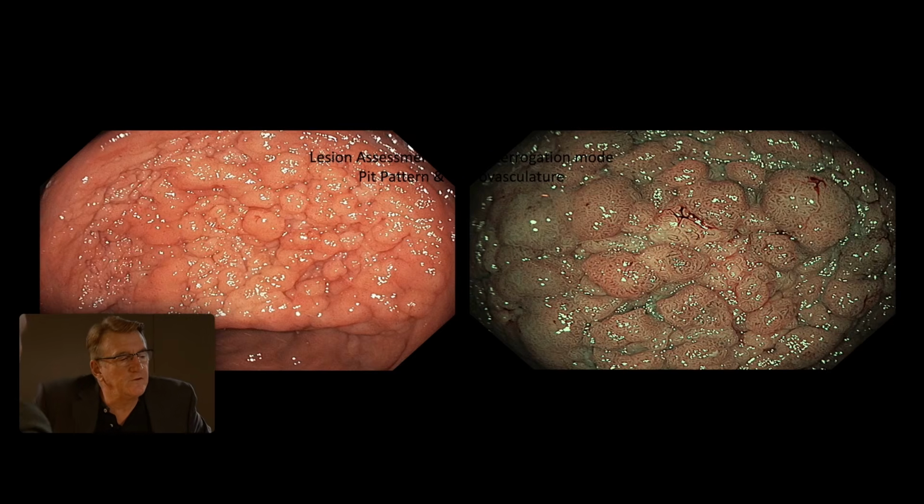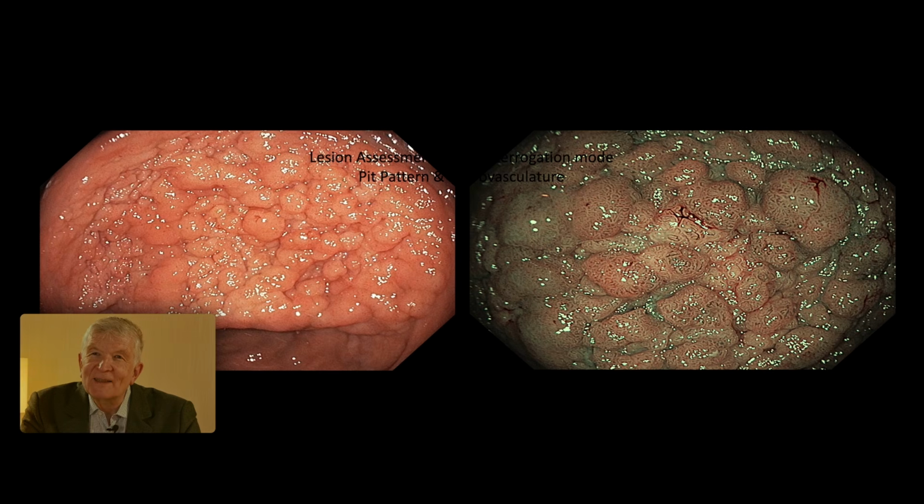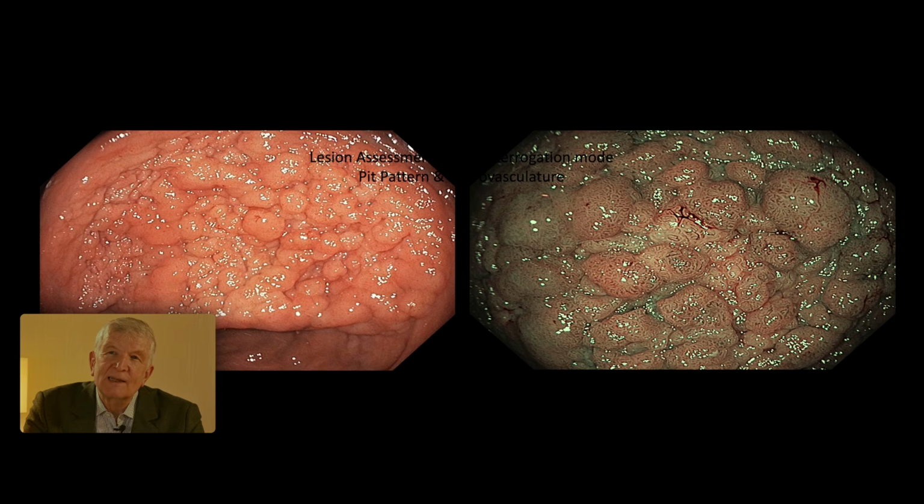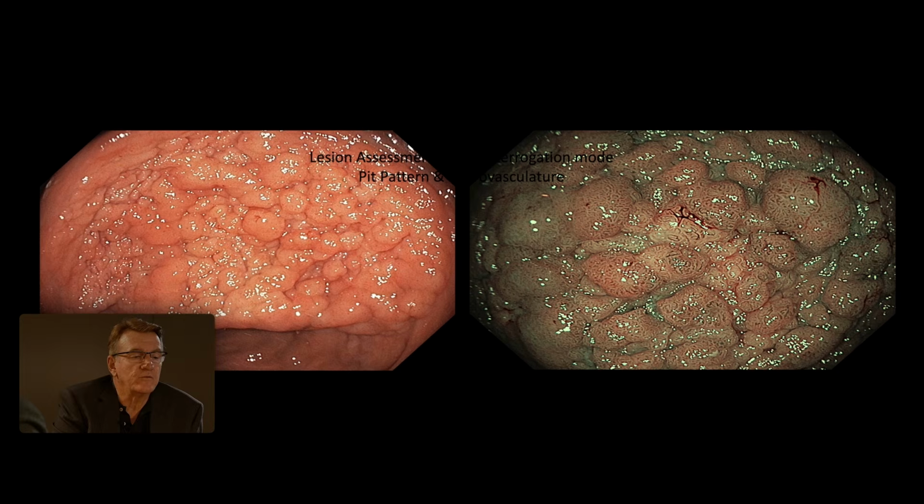Yes. So this is a large non-pedunculated colonic polyp. It's an adenoma. It's probably half the circumference, which you see on the left side, maybe a 4 centimeter lesion, 4 to 5 centimeters.